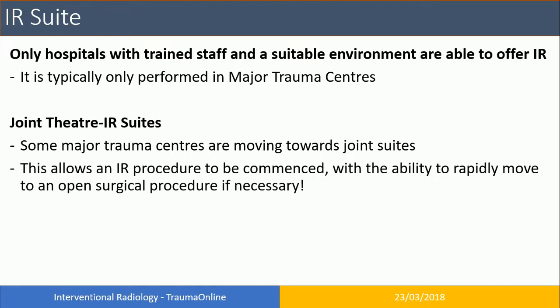So at the moment, this is predominantly only done in major trauma centres because you require staff who are trained in interventional radiology, and you require a suite in which you're able to perform interventional radiology because you require the live X-ray imaging and the use of catheters and things like that.